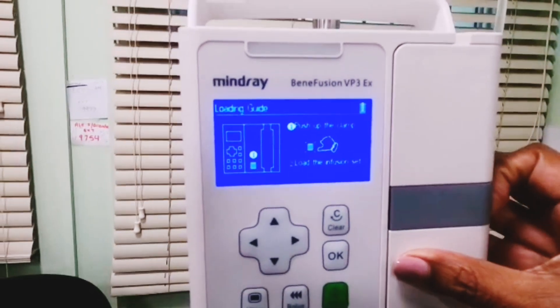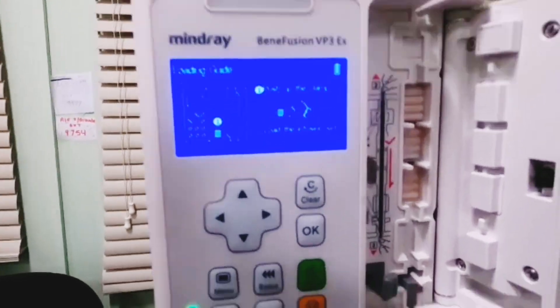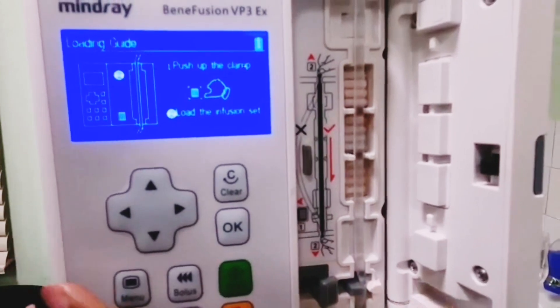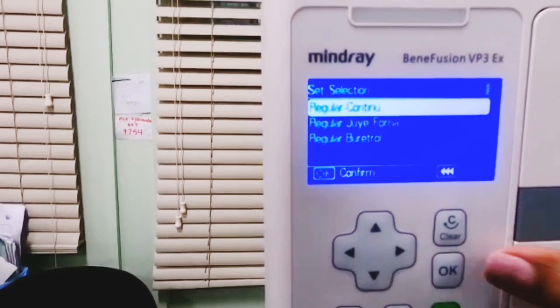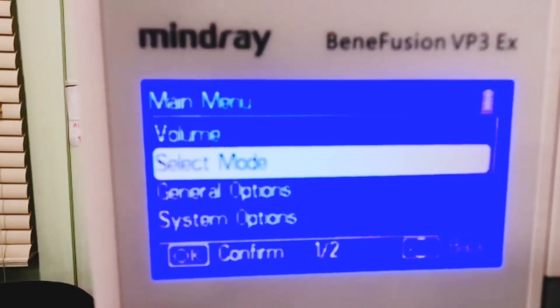We're going to open the canister on the IV infusion pump, insert the line by pulling the lever and pulling the line towards it, then close the canister. Click on the regular continue option to proceed to the main menu.